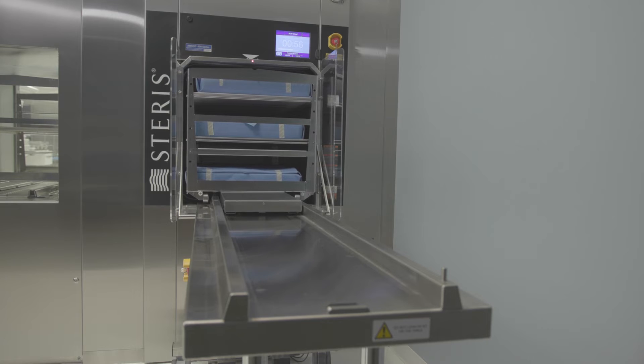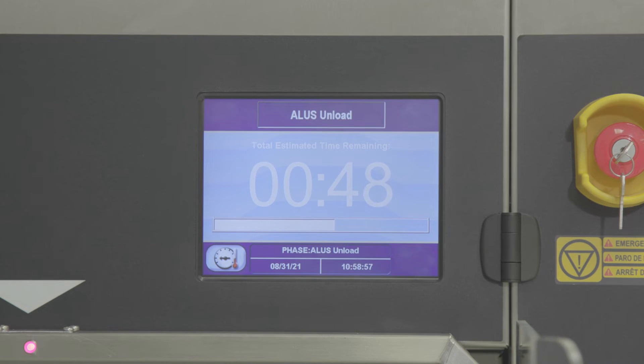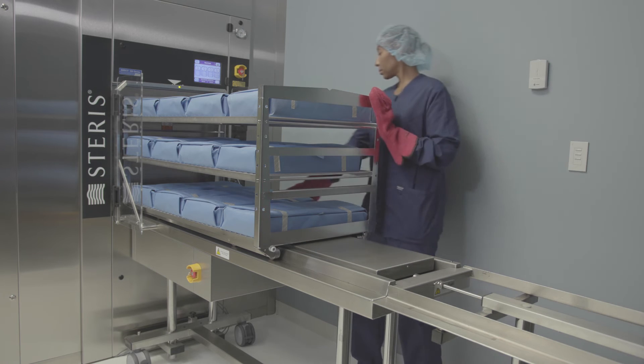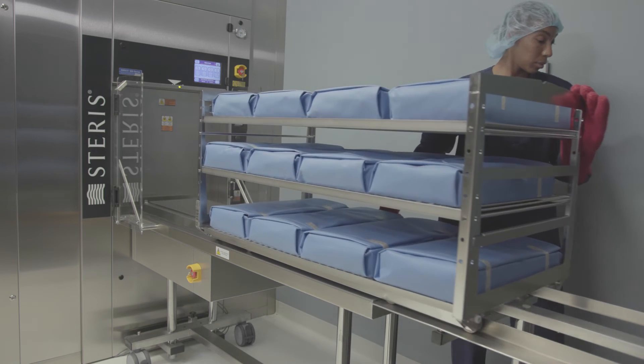You'll hear a beeping sound, which indicates the automatic unloading process has started. If a loading car is on the unloader table, the system will not unload the processed instruments until the previous load has been removed. Sterilized loads should be removed from the table to a cooling area away from air conditioning ducts, so the next loading car can be unloaded promptly upon cycle completion.